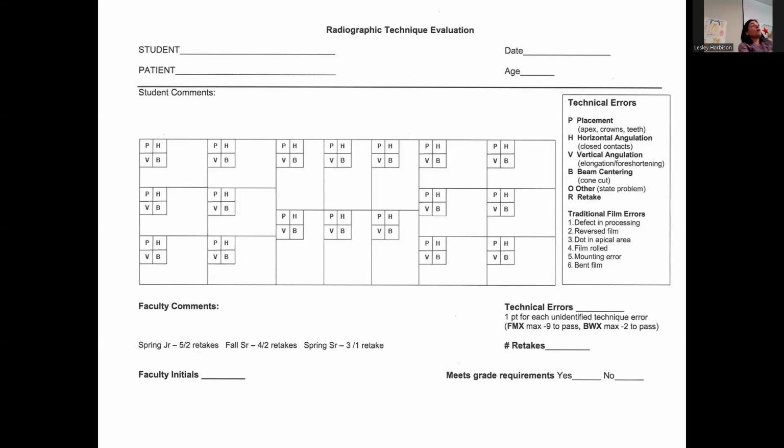So if you need to move anterior and maxillary or up, then shade anterior and up. And a lot of you did this, you just instinctually figured it out. But remember, right through the center is the midline. So anterior will be over here on this side, but anterior will be over here on the other side. So anterior is not the same on every box.